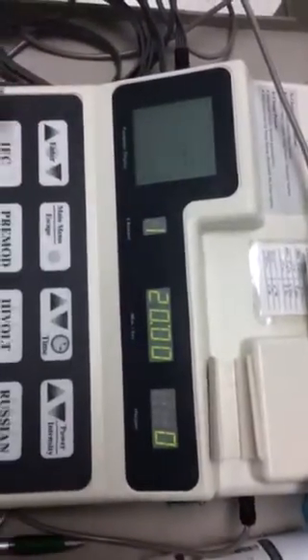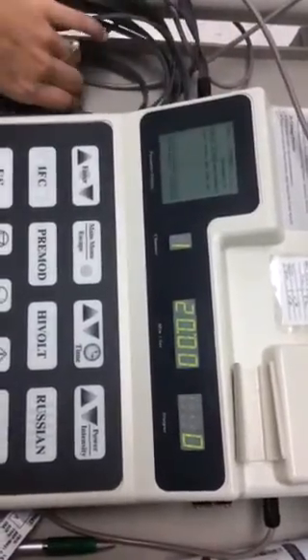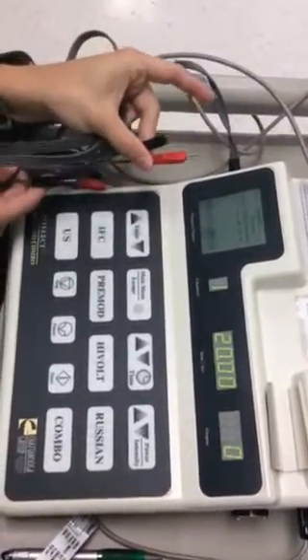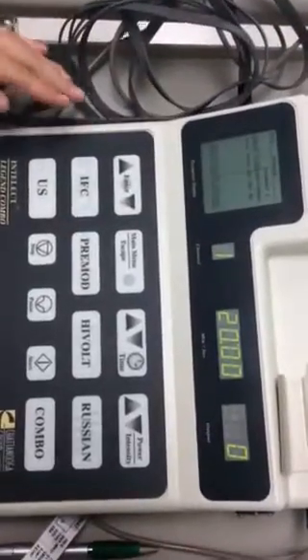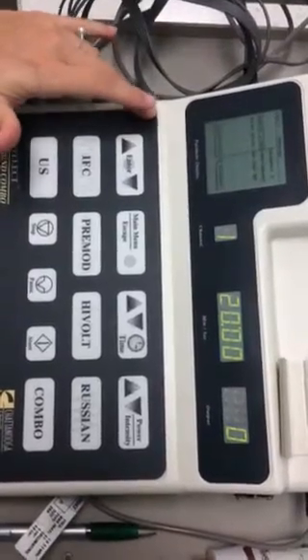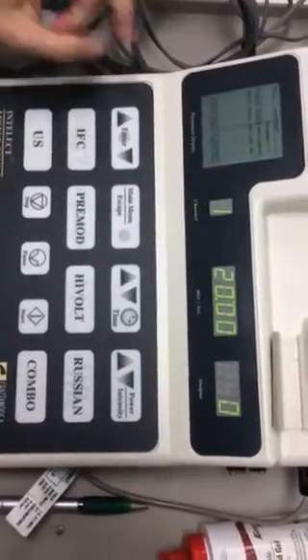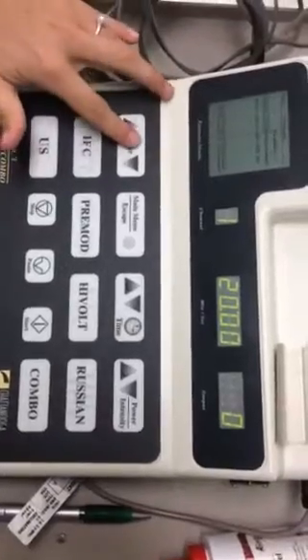Okay. The next is pre-modulated. Do note the channel that it is on. Since it is on channel 1, you cannot change it. Make sure you pick channel 1 lead. With pre-modulated, we want to evoke a contraction, because if you were using this for pain relief, which you can do, it only uses 1 channel. You're going to get a small area that is getting treated rather than using the IFC with a larger area.